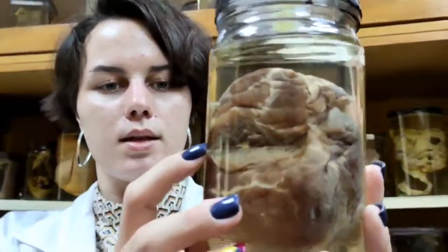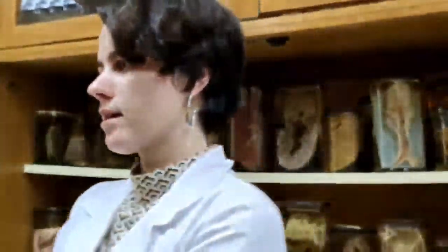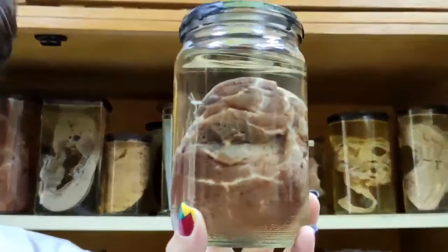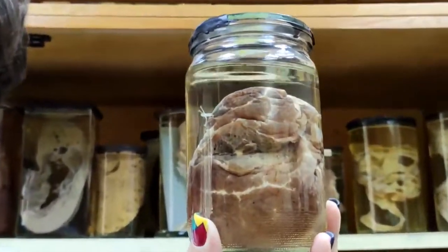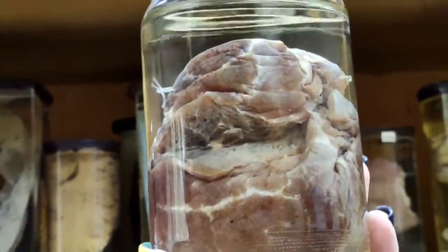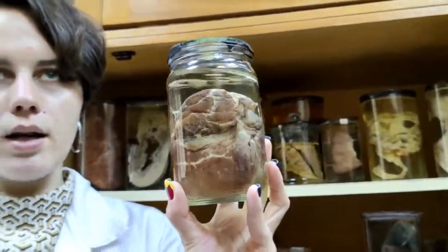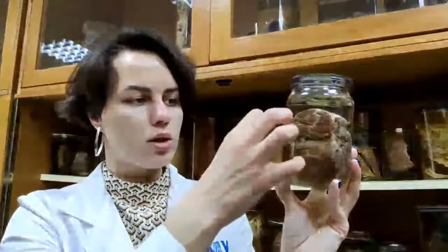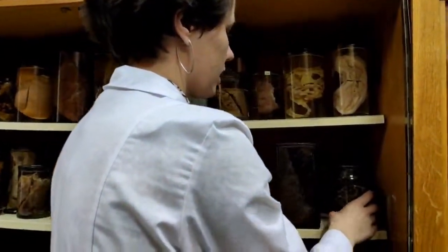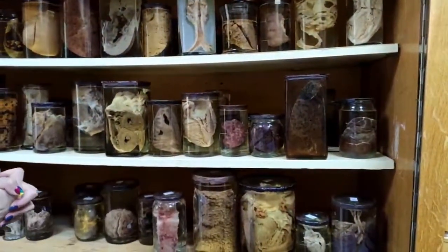You can see that it has a very cystic organization, because emphysema means that the interalveolar tissue is destroyed. That is why we can see a lot of small cavities in the lung. Of course, this is bad because there is no metabolism in these tissues, because all the interalveolar spaces have only air without any tissue.